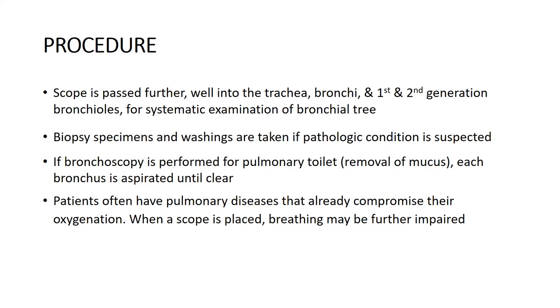If bronchoscopy is performed for pulmonary toileting, each bronchus is aspirated until it is clear. And in patients already having pre-existing pulmonary diseases, performing this bronchoscopic procedure may further impair their breathing.